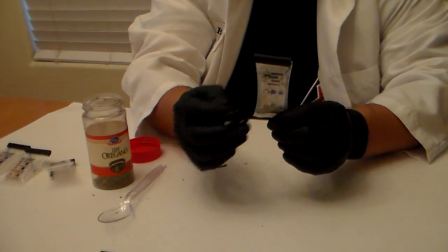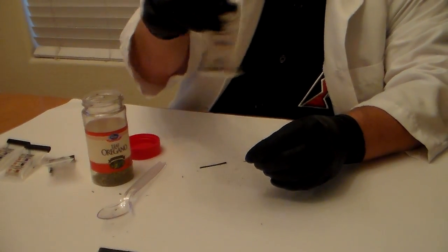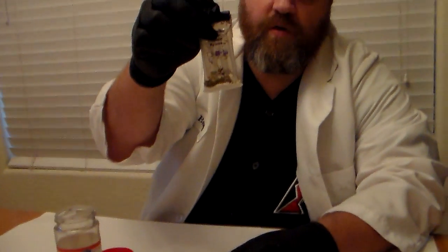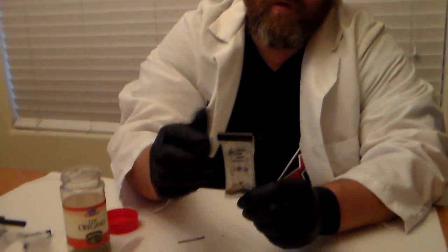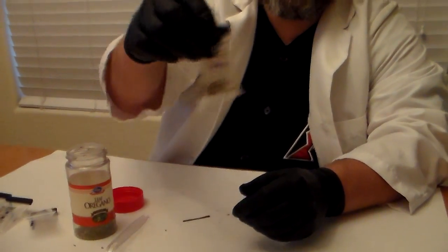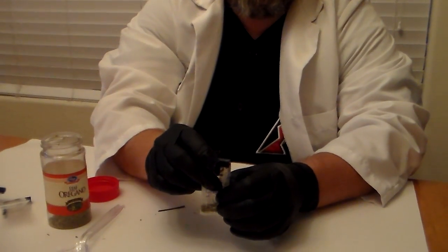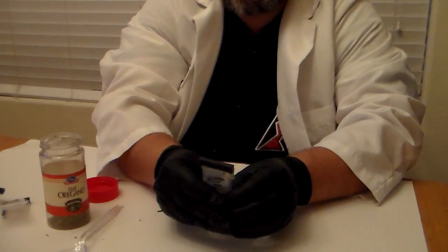Now I'm going to test the oregano. Again, I'm going to break the three vials one at a time — the one on the left first. Shake it. We see no color change. Now I'm going to break the one in the middle and shake it. If this were marijuana like the last one, we would see a color change — we would see it turn purple. Right now we're seeing basically no color change. I'm going to break the last one just for good measure to see if we get some sort of change. We see no color change.